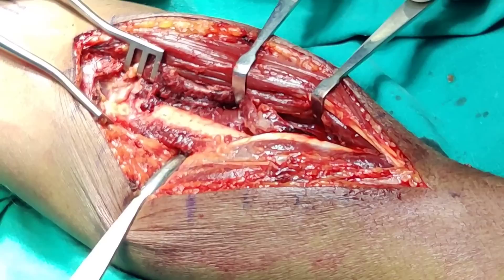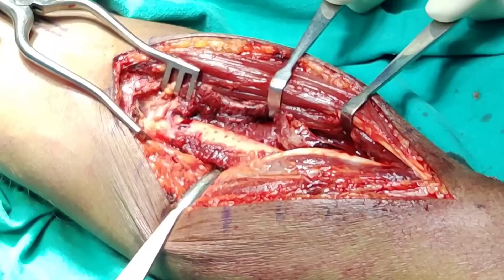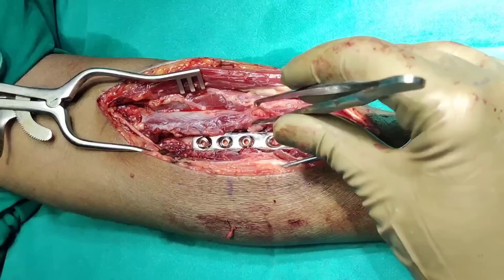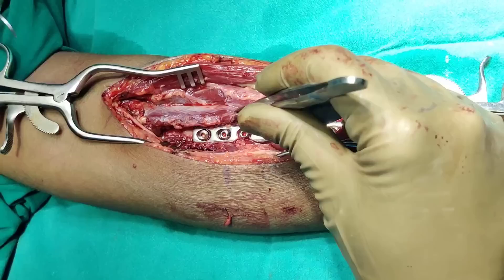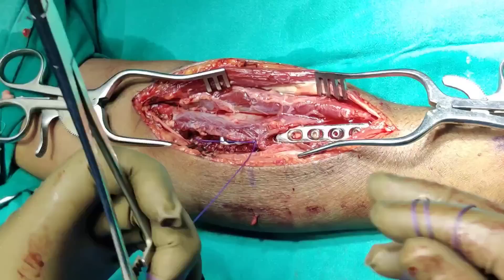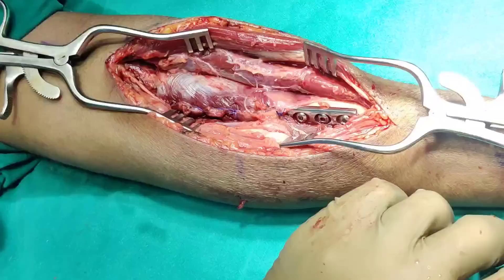I just wanted to show you the approach — fixation principles will be pretty much similar. Because it is a multi-fragmented fracture, I am going to use the plate in bridge mode and will not compress it. This is how you do an exposure or proximal Henry approach for a proximal third radius fracture. Our final fixation is done — you can see we have reduced it anatomically. This was a month-old fracture, so nothing in India comes easy. In terms of closure, for the deep layer I have left a sleeve of supinator and I will just put some tag stitches. I like to recreate the anatomy that I have disturbed.